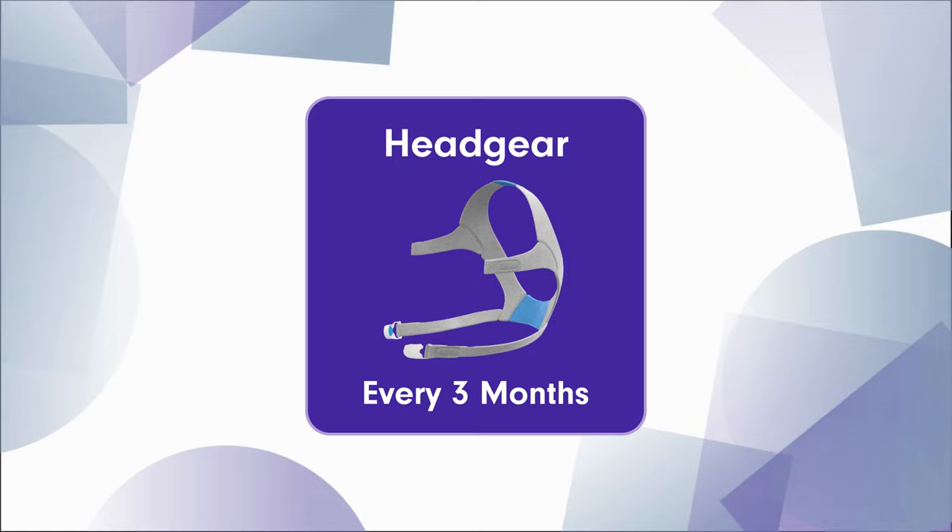Another key component for your CPAP mask is the headgear, which should be changed every three months. This is due to the velcro not sticking in its previous location and the cushion getting softer over time, which will cause you to tighten the headgear more and leave marks on your face.